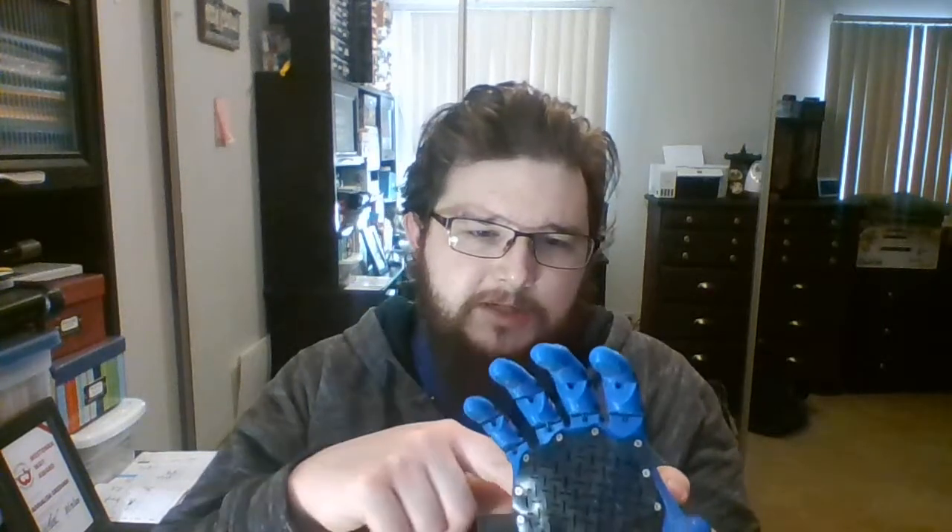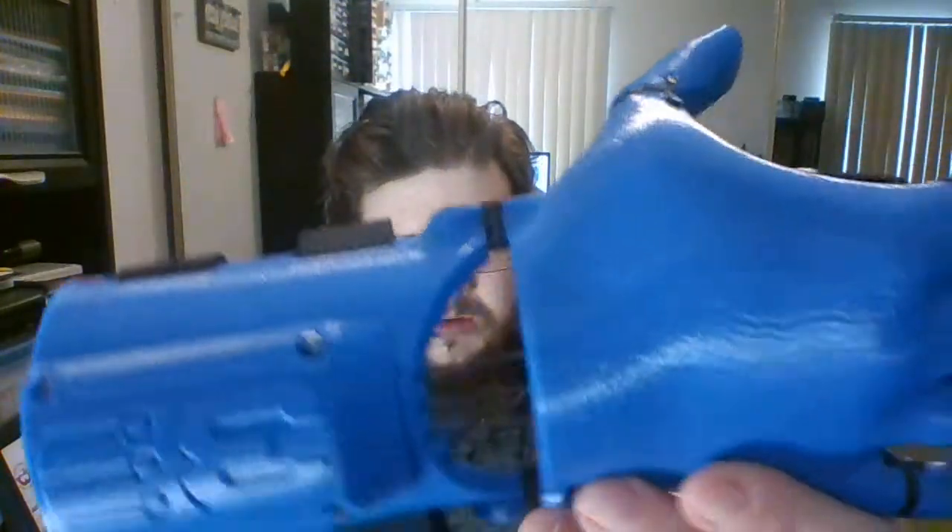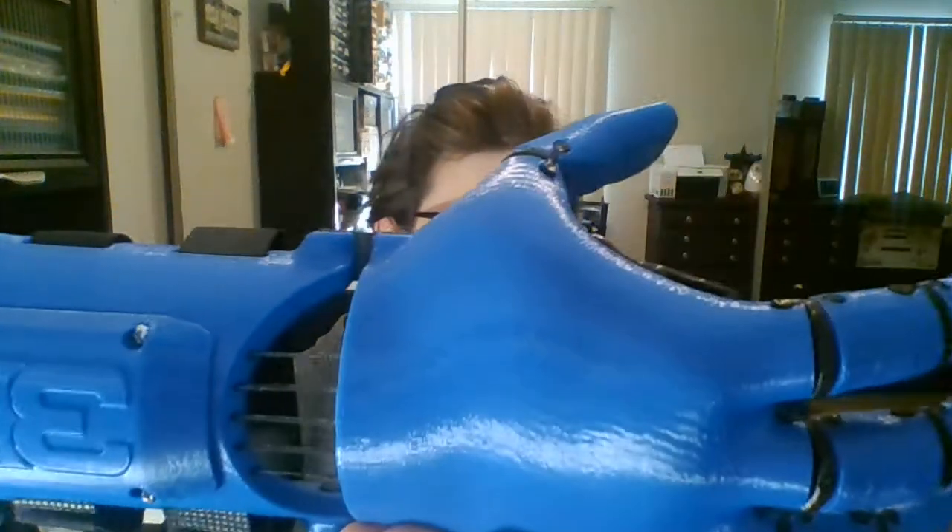All in all, it was not a terrible build. Printing the PLA components wasn't bad. TPU took a little playing with to get the settings right — like I said, flexible filaments can always be finicky like that. Thank you. Once again, my name is Dallas Gresham and this is my submission for my kinetic hand from Free 3D Hands to e-NABLE, for the fabricator and assembly badges. Thank you.